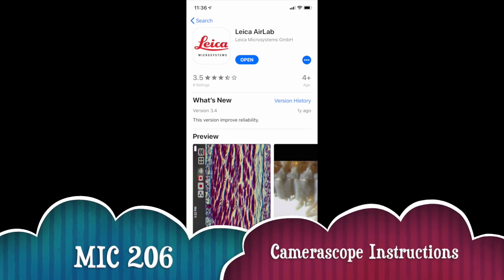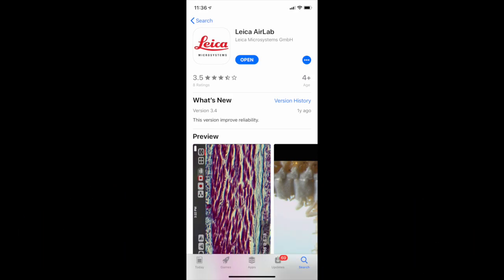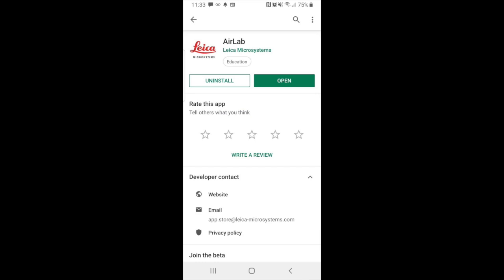To use the camera scope, first you have to download the Leica AirLab app. It is available on Apple devices on iOS, as well as the Google Play Store on Android devices.